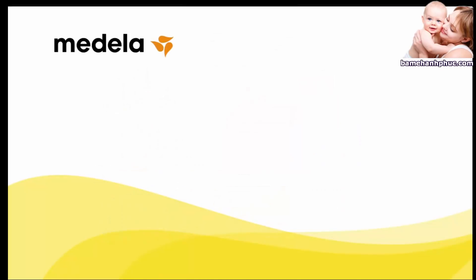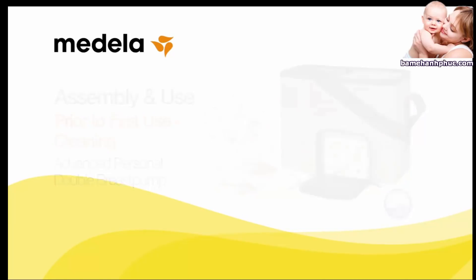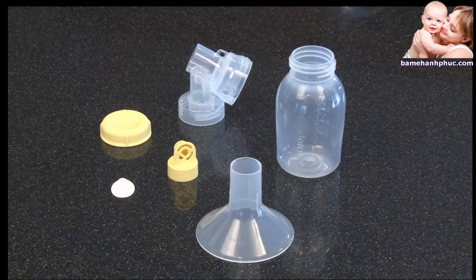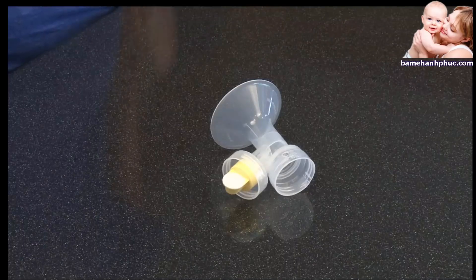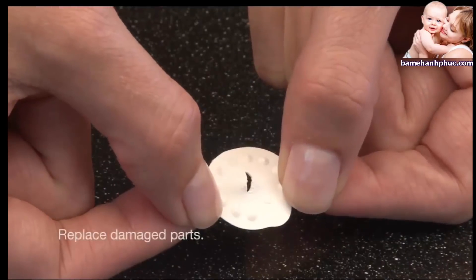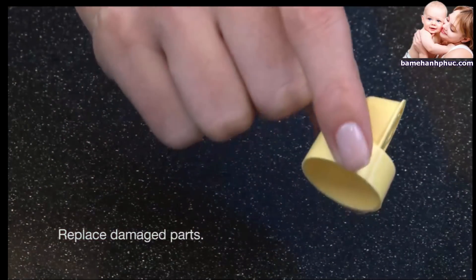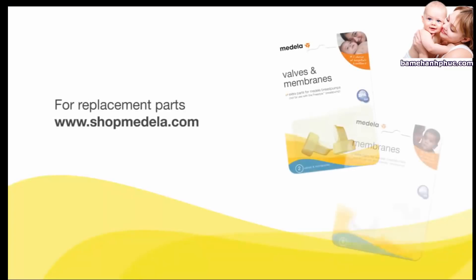Before assembling your Advanced Personal Double Breast Pump for the first time, separate, wash, and boil all the parts that come into contact with the breast and breast milk: breast shields, connectors, valves, membranes, bottles, and lids. Be sure to remove the yellow valves from the breast shield connectors and separate the white membranes from the yellow valves. Inspect the white membranes for holes, tears, or warping, and check the yellow valves for cracks or chips. Any damage to these parts could compromise suction and the performance of your pump.